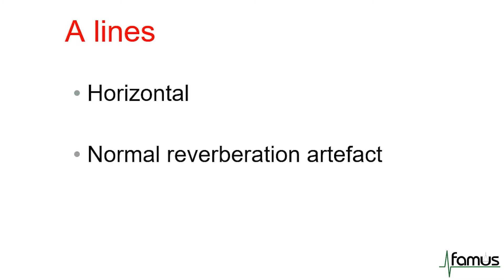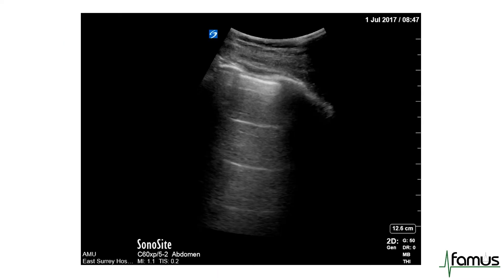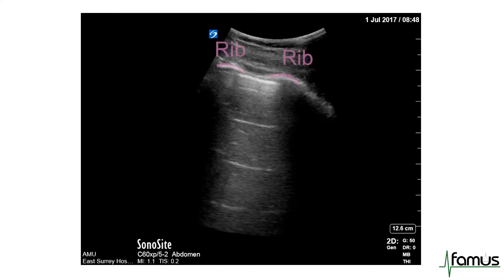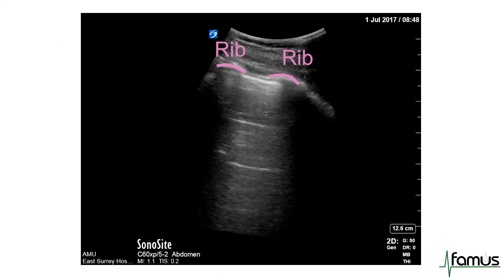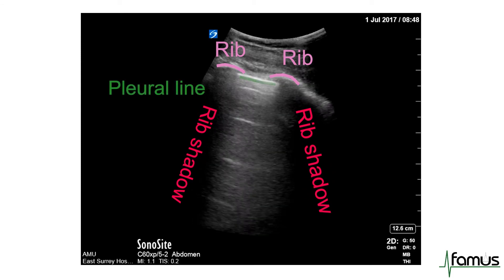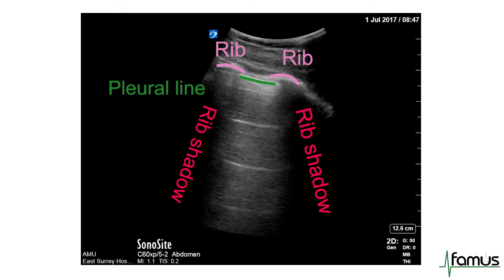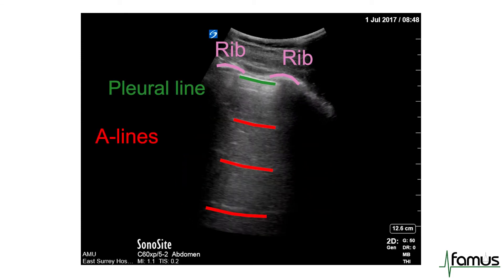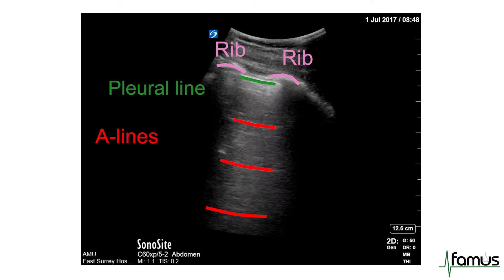A lines — they are horizontal and are a normal reverberation artefact. They tend to imply that the lung is dry underneath. In this example video, you can see the two ribs casting a rib shadow with the pleural line in between and multiple A line reverberation artefacts underneath.